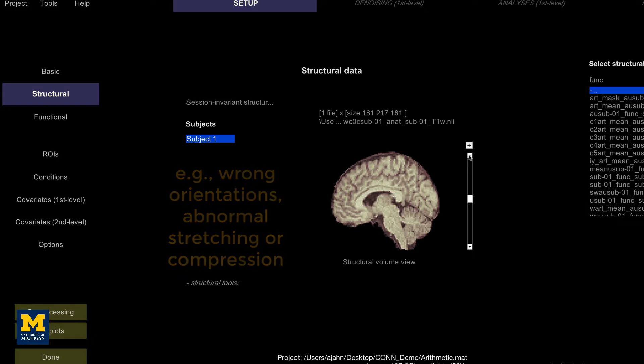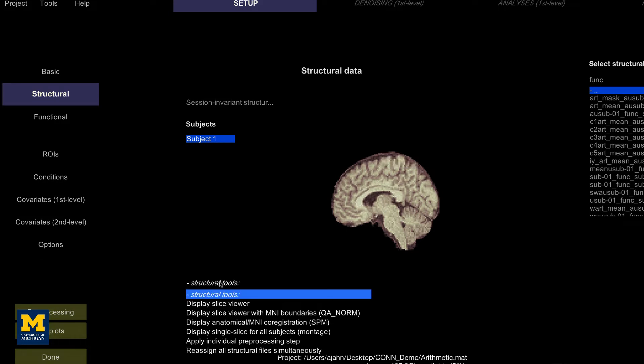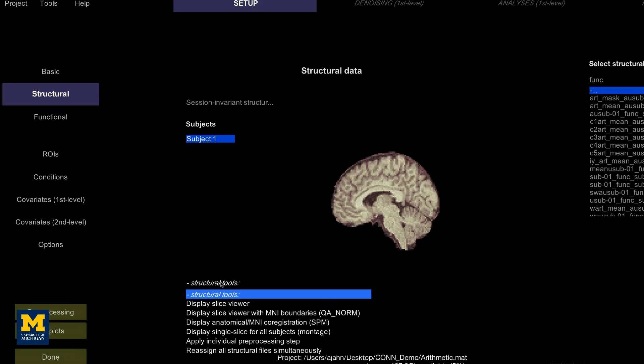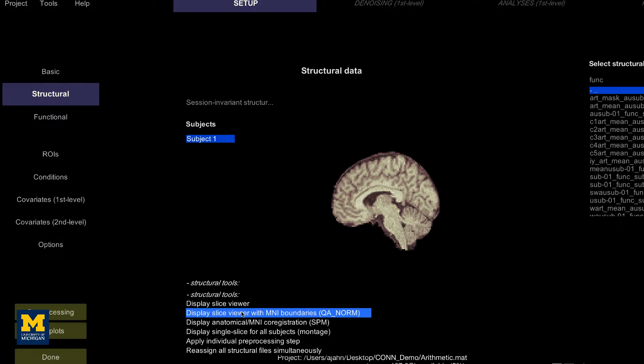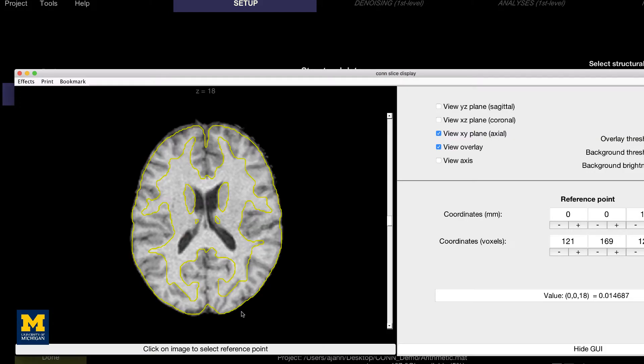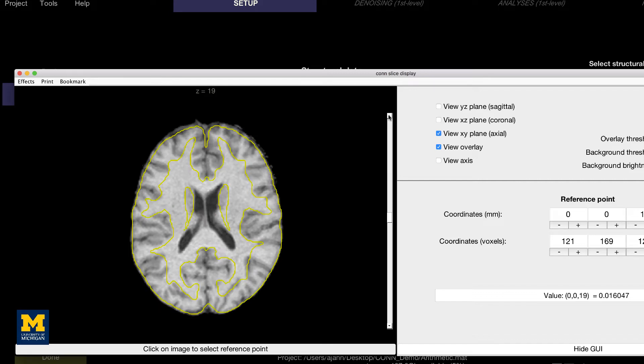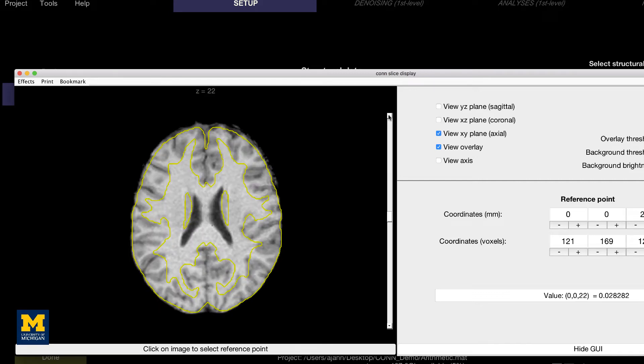We can examine the image more in depth by using some of the viewer options. If you click on the structural tools menu and select slice viewer with MNI boundaries QA norm, you will see the outlines of the MNI template traced in yellow on top of the anatomical image. Observe how the yellow lines roughly outline the boundary between the white matter and the gray matter. The normalization won't be perfect, but the general outlines should match up.